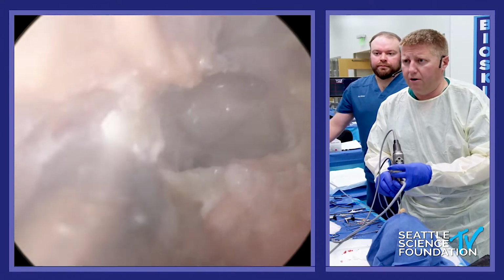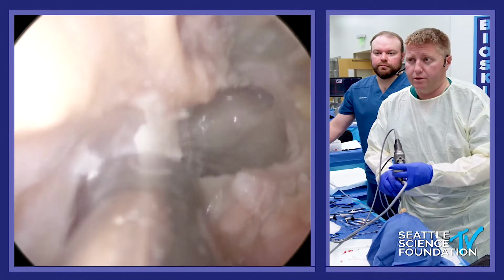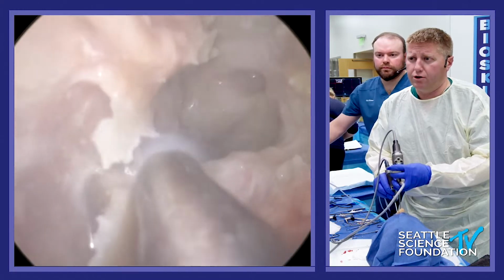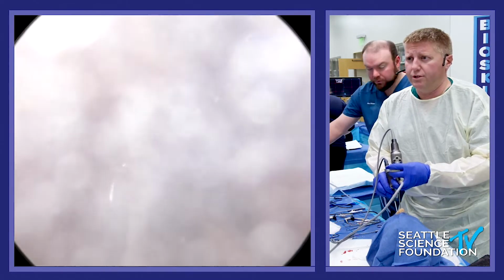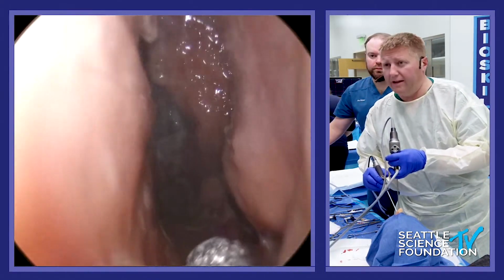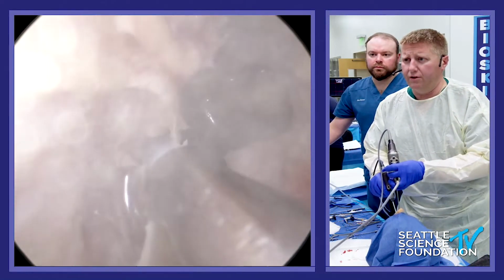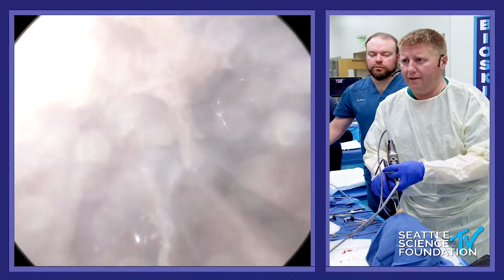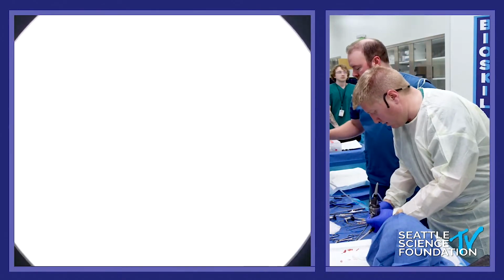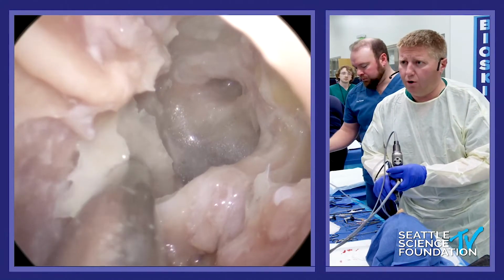Now, one of the things you notice here, this does suction, but some of the drills don't. Some of the more skull-based burr drills don't. So actually what I do is I take a flexible suction and put it in the contralateral nasal cavity, just in the nasopharynx, and just leave it there. And it really gets all this smoke and bone dust and debris out of the way so that you can keep moving efficiently. Even with the ones that do have suction, having that extra layer of removal can be quite helpful.